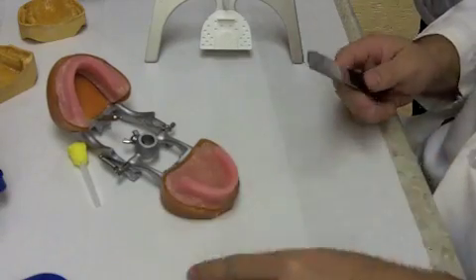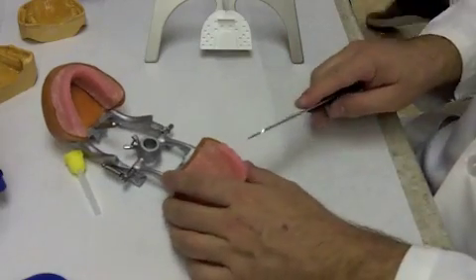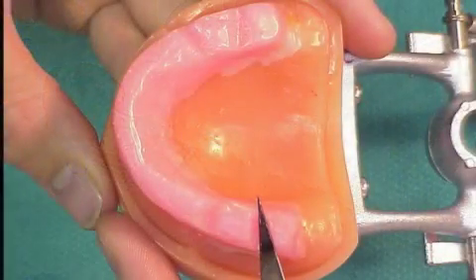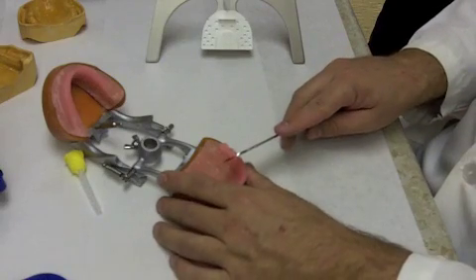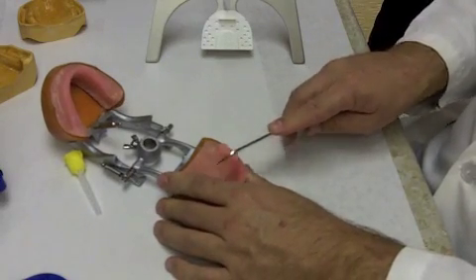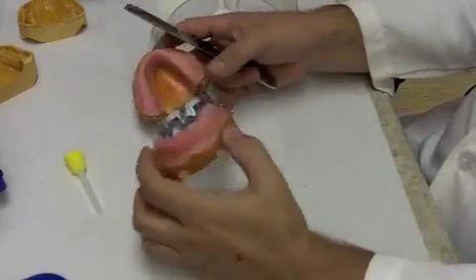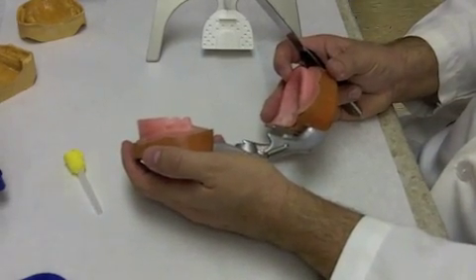Once you're done with that, then you want to put a couple of good notches on each side of the maxillary rim. Again, this is just to allow the registration material to index into these notches. So remember, they're not just small little notches, just like in the cast. You want to have a couple of nice positive notches that when registration material flows into them, you will have a nice area for the material to interdigitate with.